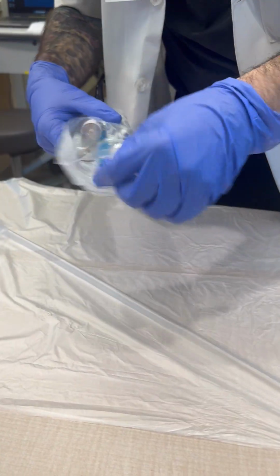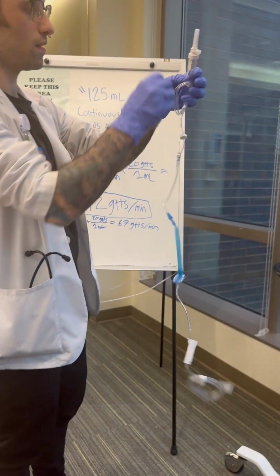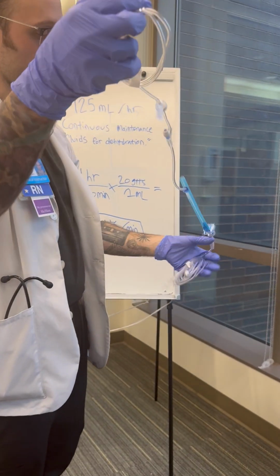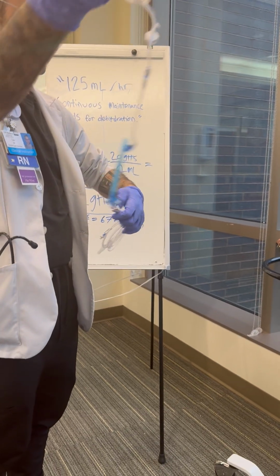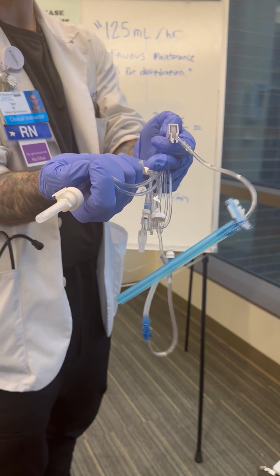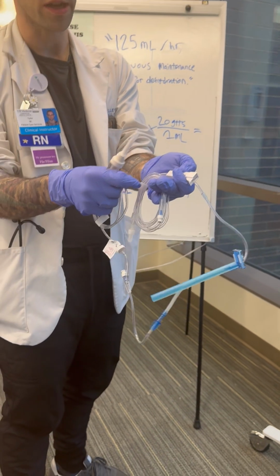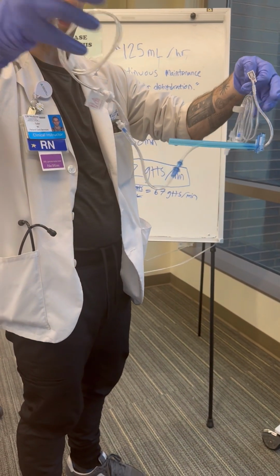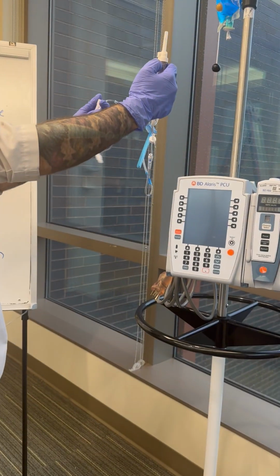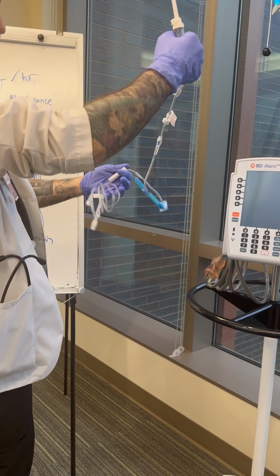Open up my tubing here. A couple things to keep in mind. I like to have control. So don't right out of the gate rip this tubing off, or the packaging. So it's all nice and coiled up. The reason I like that is I have a lot more control over everything, and I'm not worried about the tubing touching the floor, so it's just easier.